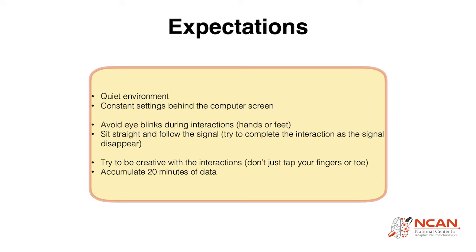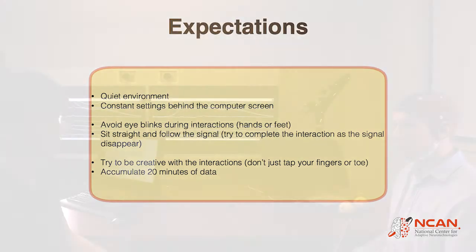In the calibration session, the subject will move their hands according to the stimulus cue. For our experiment, the subject is expected to squeeze the ball with his left or right hand based on the cue, and avoid movements during the baseline periods. It is recommended to collect 20 minutes of data.